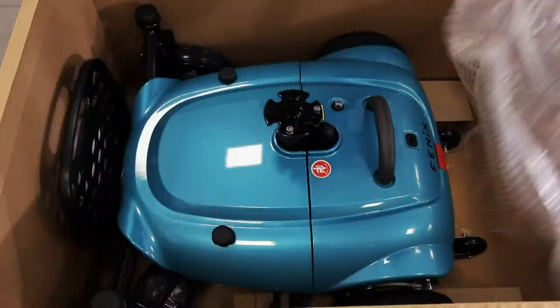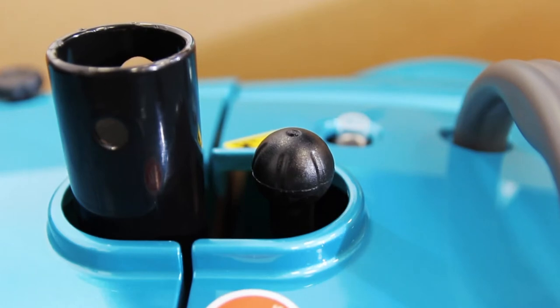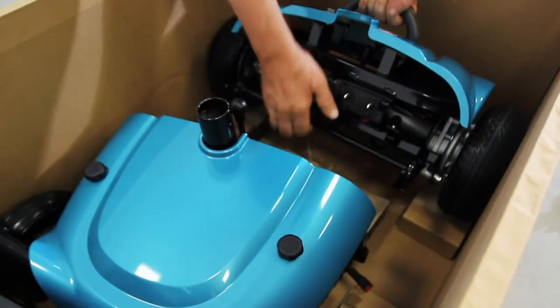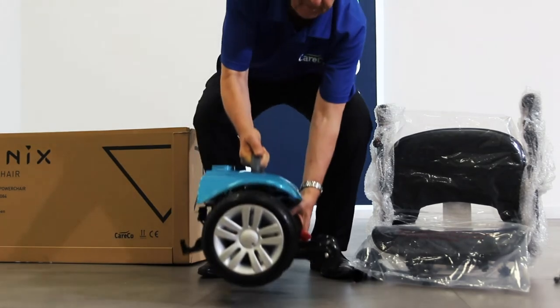To remove the remainder of the power chair, we recommend you split the front and rear sections, as they are quite heavy when combined. Pull the lever located behind the seat post. This will disconnect the front and rear sections, which you can now pull apart. Lift out the front and rear sections separately and set them aside.